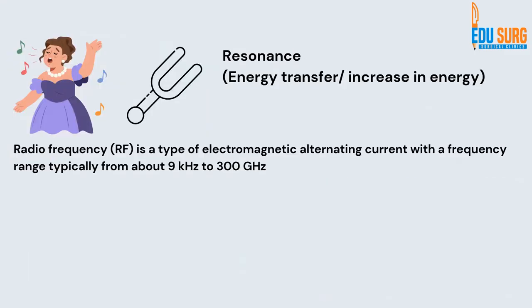As doctors, I am sure you have seen a tuning fork. When you use two tuning forks, you slap one, it produces a sound, but if you stop it and the other one is close by, the other one starts moving, right? That is also resonance. So it is energy transfer or increasing energy when the frequency matches. So tuning a radio, the radio station's frequency has to match the radio circuit frequency. Swing, the flow of the swing has to be the same.